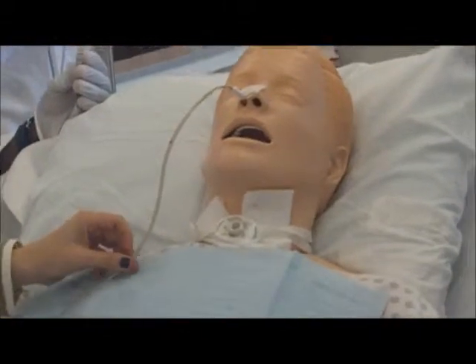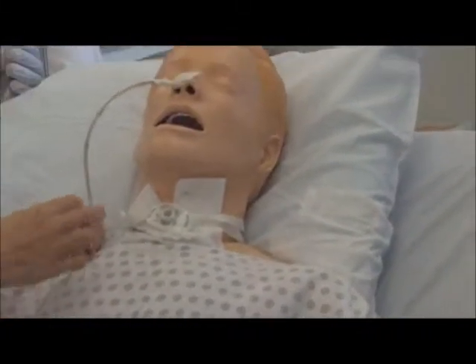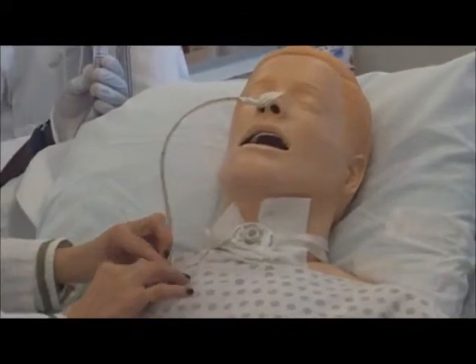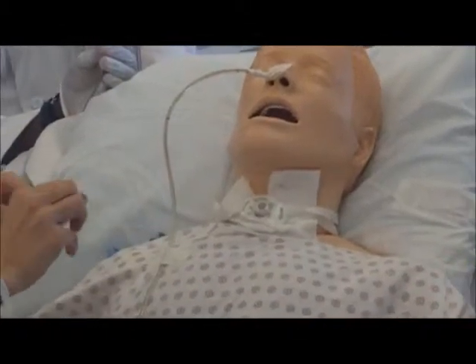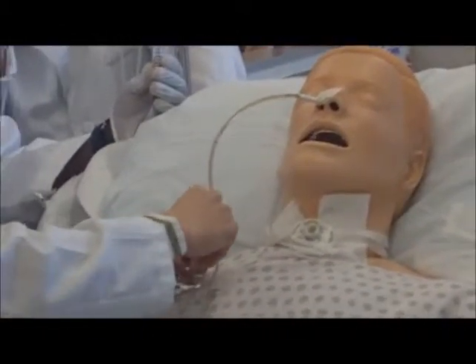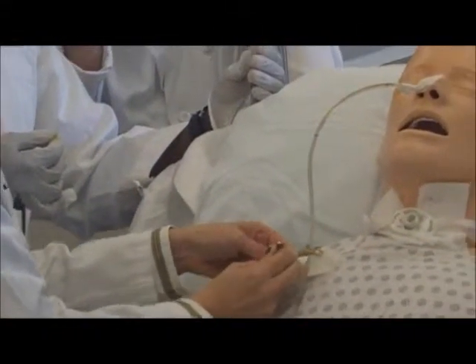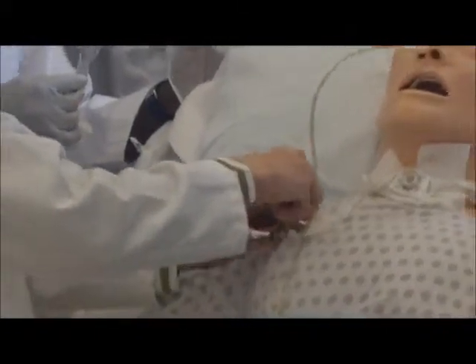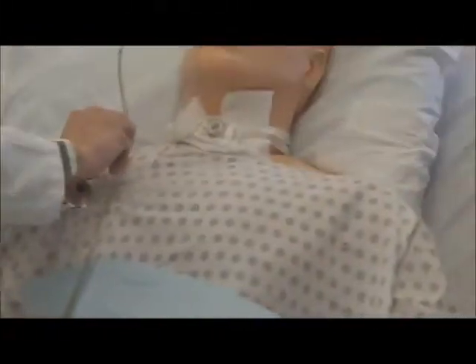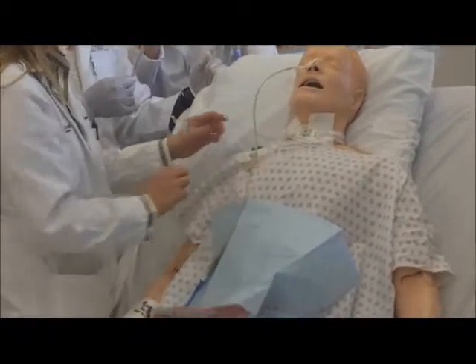Now what I usually do with the tape, you don't want it kinked up like this. You want it pretty much like this. I usually just tape here. We really don't use safety pins in the hospital, but since they have a safety pin here, if I were to use one, I guess they say you can knot around this, do a slip knot, and then tape it to the gown. So if you're going to do that, just make sure that you're pointing it downward. Or if you want to just tape it and not twist the rubber band around, that's fine. And just tape it so it goes down here.